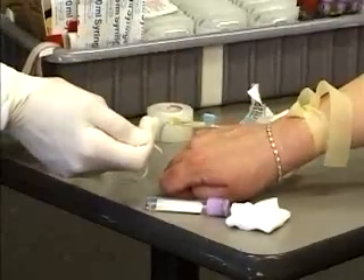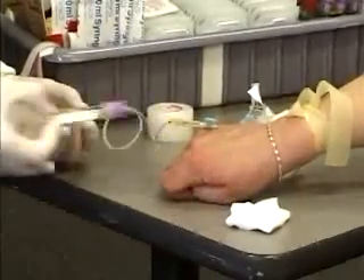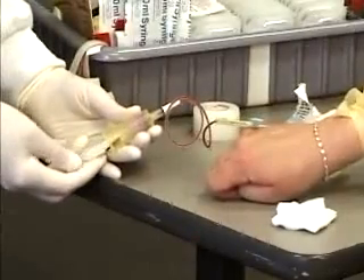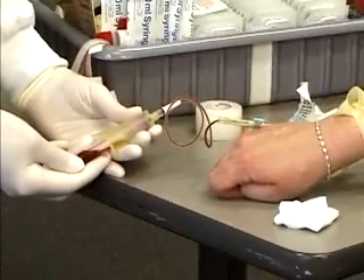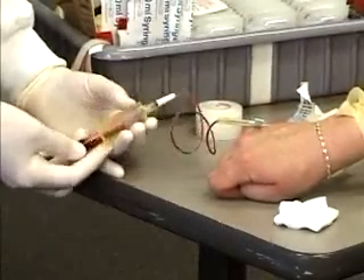With the butterfly, you'll see a blood flash back into the tubing before you even put your tube on the vacutainer holder. The blood will start coming into the tube, and you just apply the tube as before. This is a 3 ml tube so it won't totally fill, and you can rock it as the blood draws in.